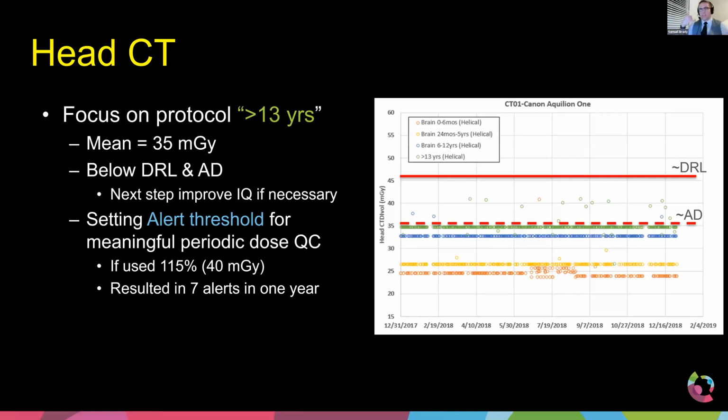The technologist called the radiologist up and said, "This is what happened. Do you want me to scan again?" And the radiologist said, "I need these scans for whatever reason." So they reload it, get the contrast back, and they go to scan again, and something else goes wrong. I mean, this is just the worst case scenario you could ever hope for. And so now you have to call the radiologist and say, "It happened again. We need to do a third scan."